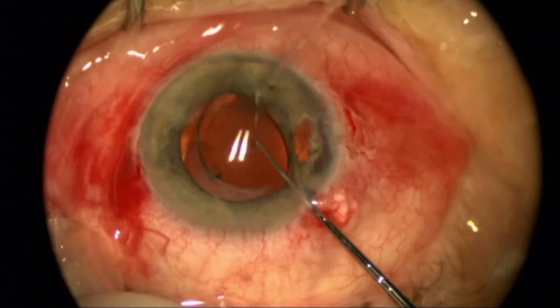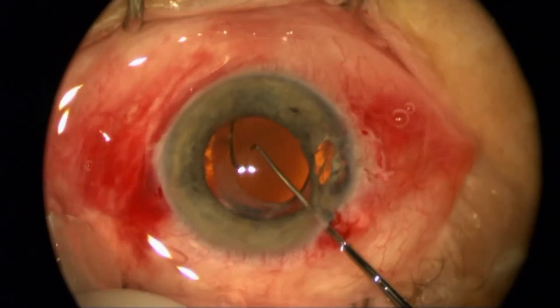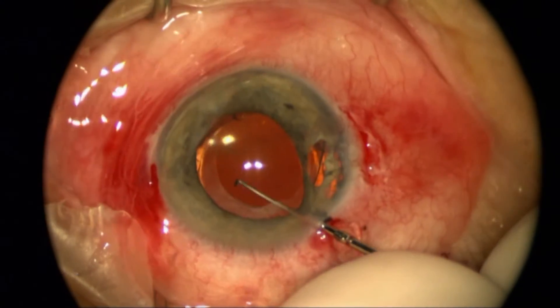However, the other loop is cocooned into some scarring, and I'm going to see that it's hard to get it completely centered. It keeps wanting to bounce back.